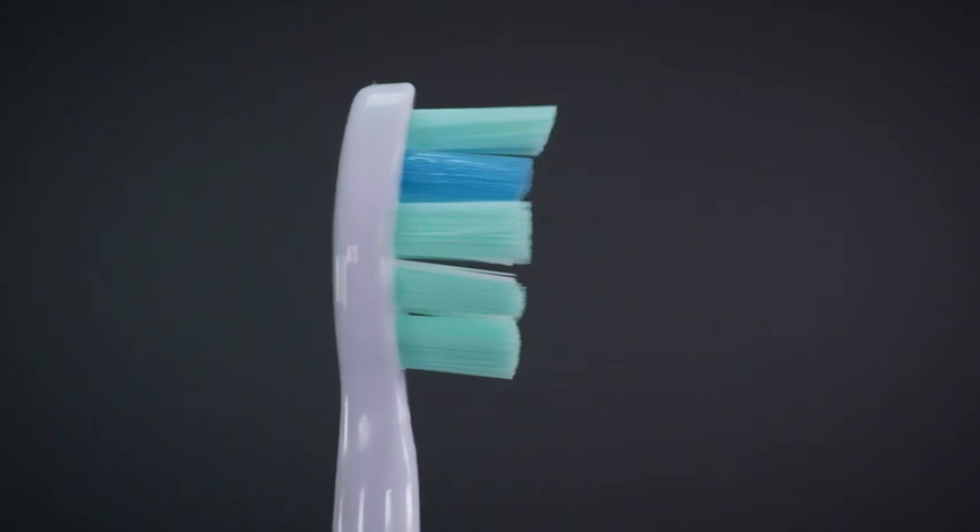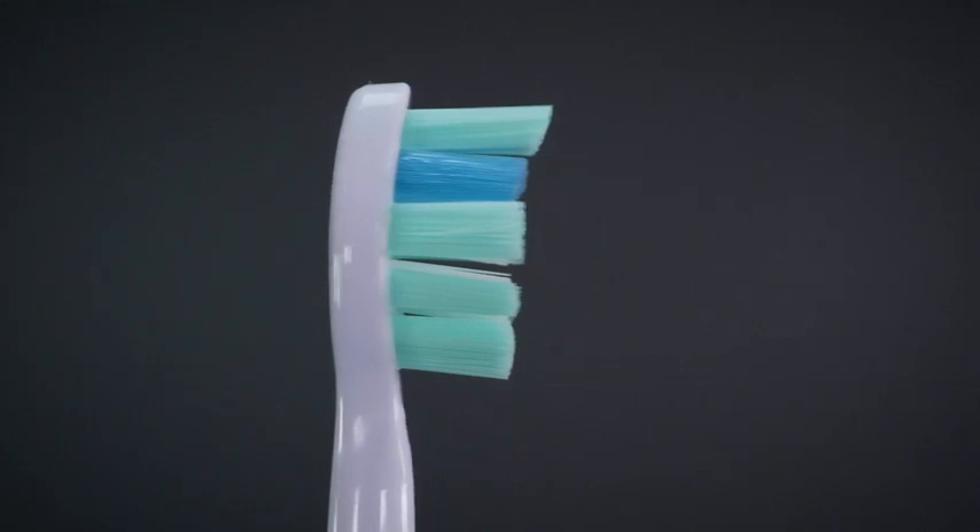If you share a toothbrush handle or multiple members of a family share a bathroom, it is quite possible you will use the same style of brush head as somebody else. It is worth knowing that there is no coloured ring or identification symbol on the brush head to allow you to know this head is yours.